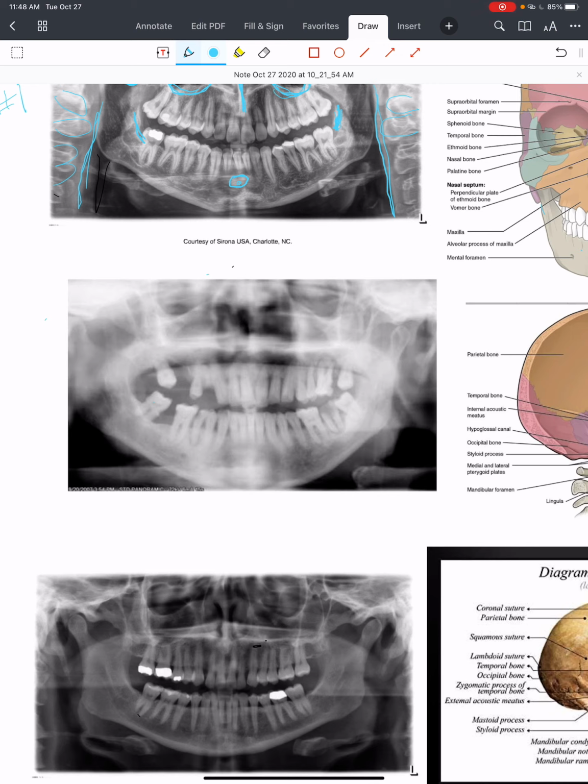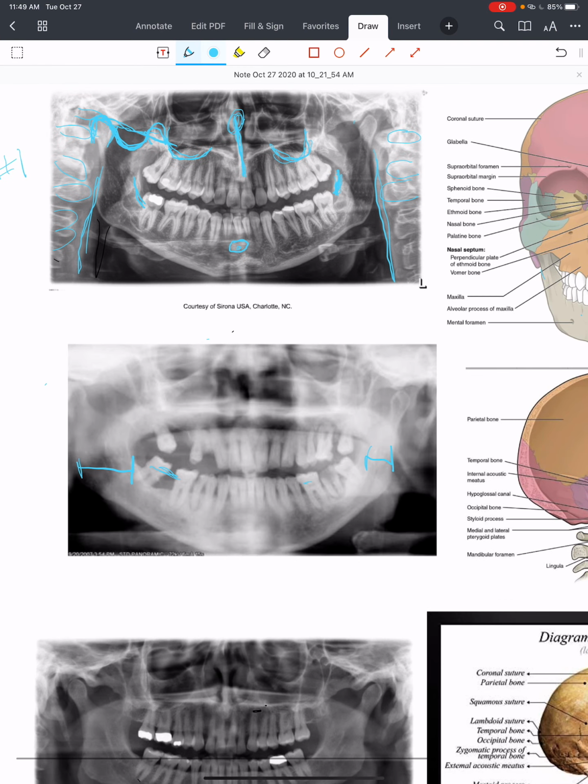So first we see that this image is obviously not symmetrical. We can see there's some distortion throughout the teeth. They look a bit wide in some areas. Also looking at this image, we can see the patient's right ramus is much wider than the patient's left. So that tells us there's some distortion, and this is all a product from patient positioning. There's also some blurring throughout the structure in the nasal structures as well. It's not clear compared to an image such as the one above.